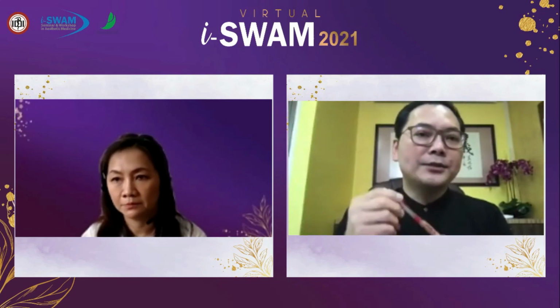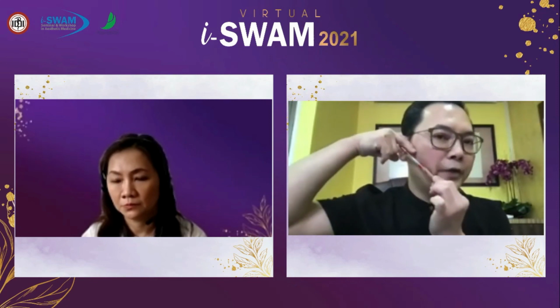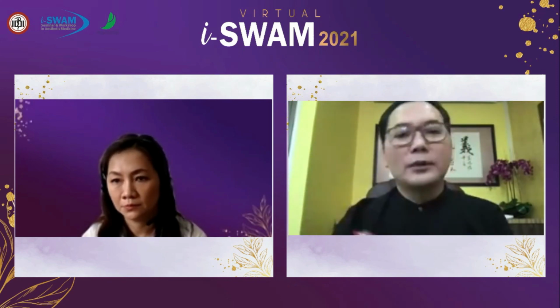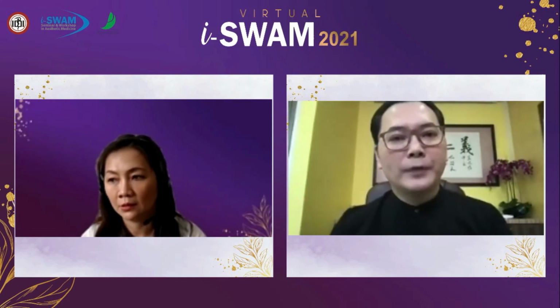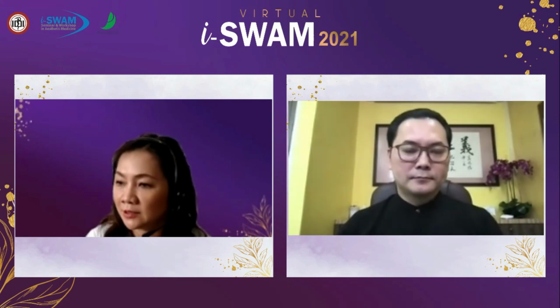So my suggestion is always try to pull and see whether the skin is moving. If the whole skin is moving and the thread is not moving, it means the fixation is still there. So you just have to trim it shorter. No need to remove the thread. Yeah. Okay, thank you.